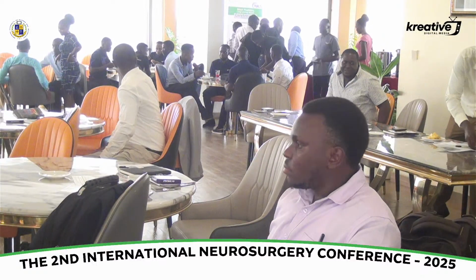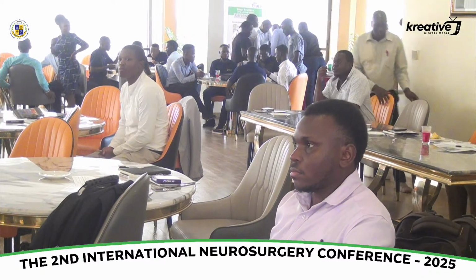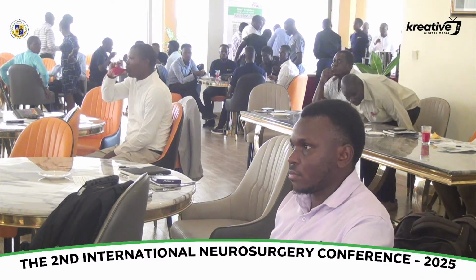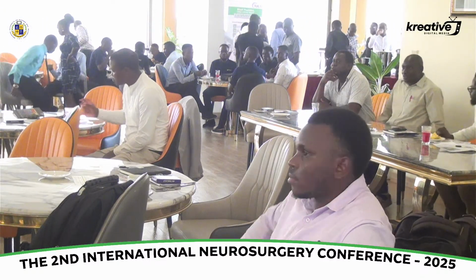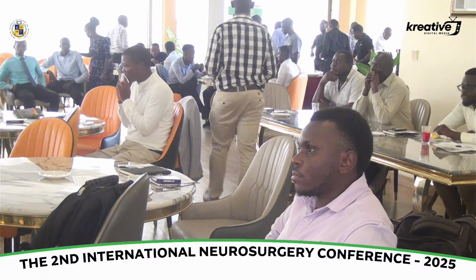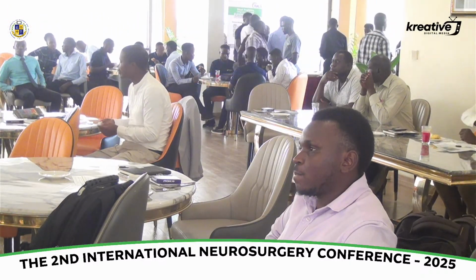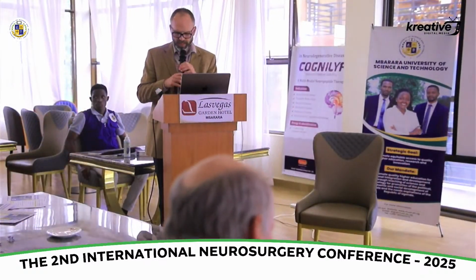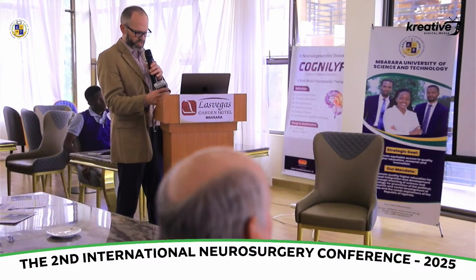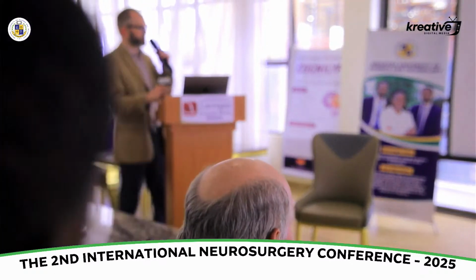You see I zoomed in, we're at 7.9 centimeters in depth, because this is an infant. You're not going to need to see further than that, and you could even make the depth less or more. Then I turn the gain all the way up to 100%. At least on this machine, you need the gain pretty high. Then you use a little ultrasound gel so that you don't get air in the way. And then, again, we start with a coronal view.